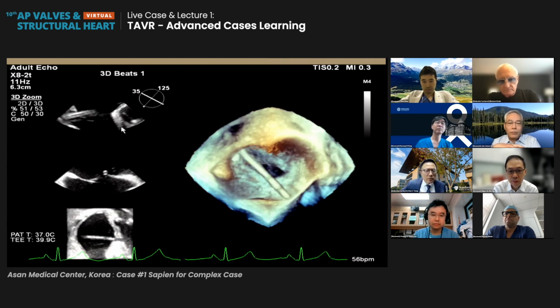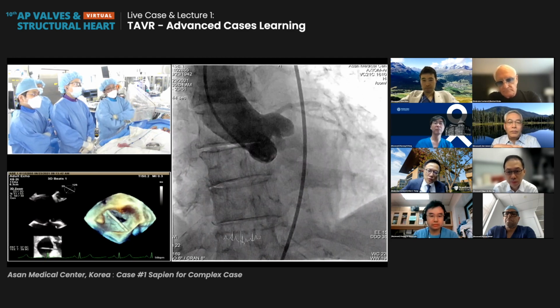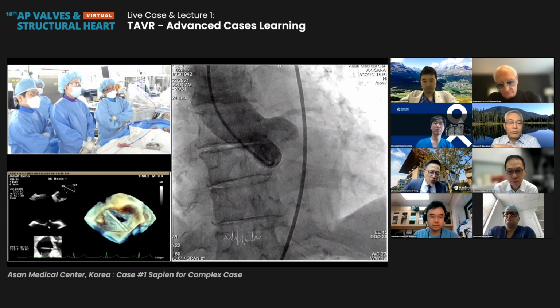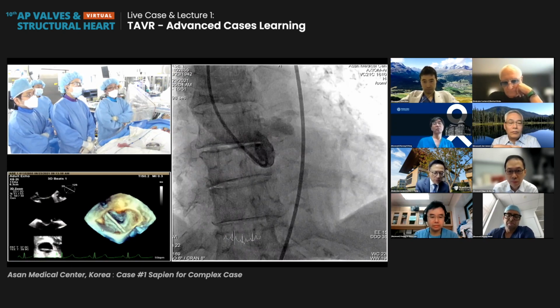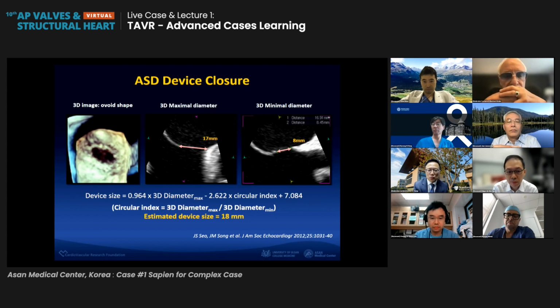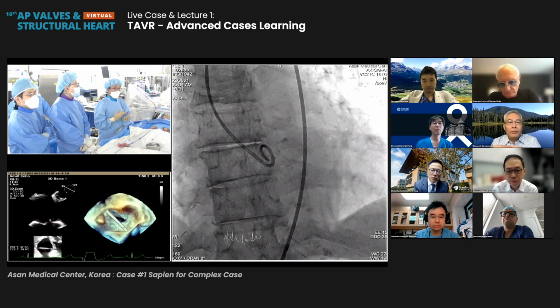Okay, so we have a relatively short aortic rim, which is not good for percutaneous closure. But if you look at the key image, we have an aneurysmal change of the septum and some hypermobility of the septum at the posterior limb. But actually, this ASD is an oval shaped ASD. The longest diameter is 17 millimeters, and the short one is 8 millimeters, and the other rims are relatively good and stable. So we thought that we won't have any significant issue in closing the ASD in this procedure.